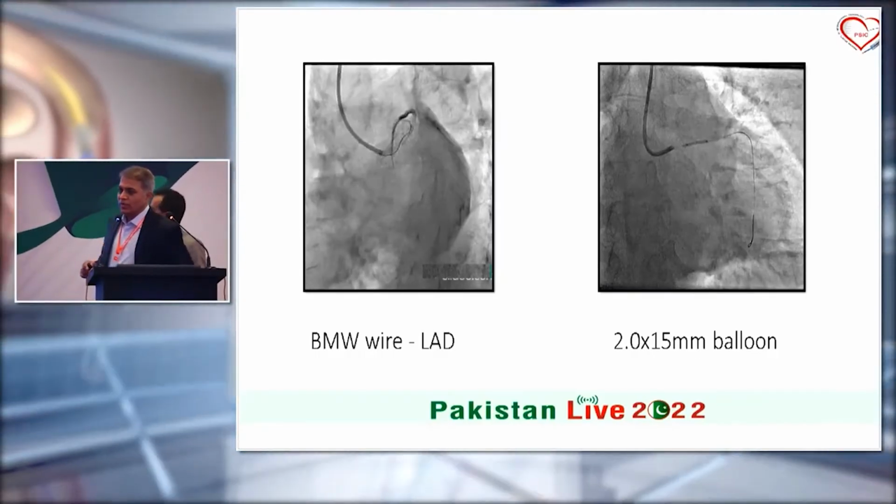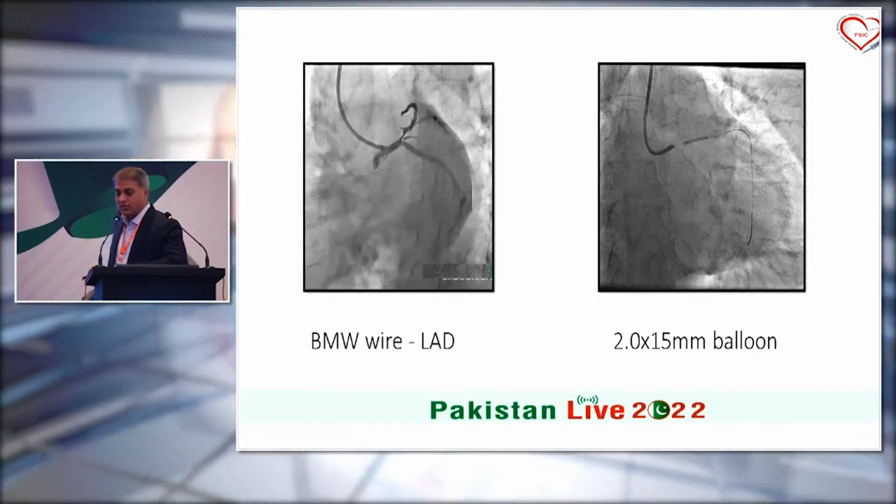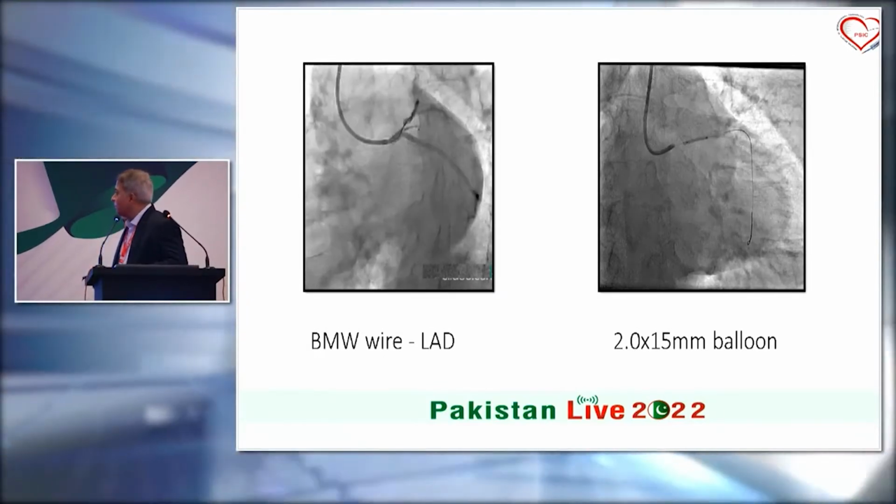Okay, let's move on. Please show us what you did. Thank you. Slides, please. There is always debate whether to put more metal into the left main if it is mild or insignificant disease, or to nail in the ostium.